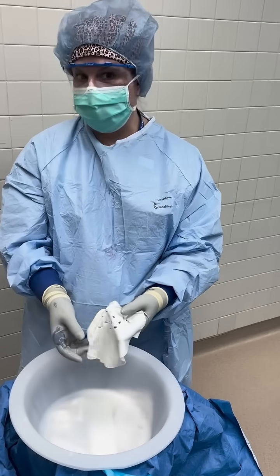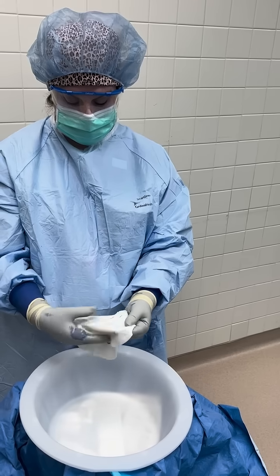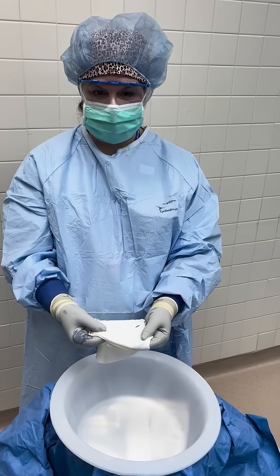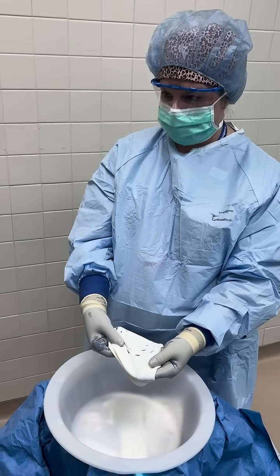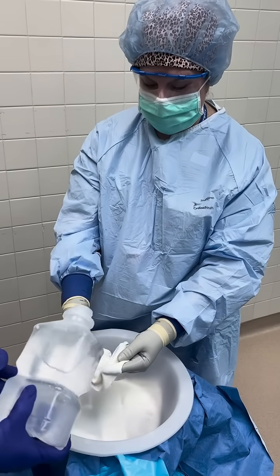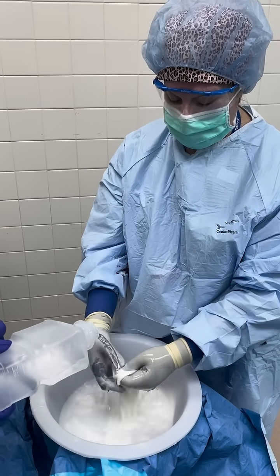We're going to take a liter of warm saline irrigation, and the nurse is going to pour it over here. Then I'm simply going to rinse it in my hand like this, to rinse some of the preservative off.